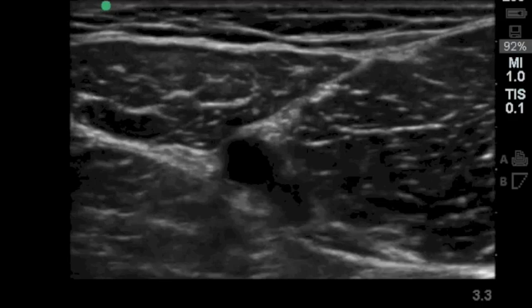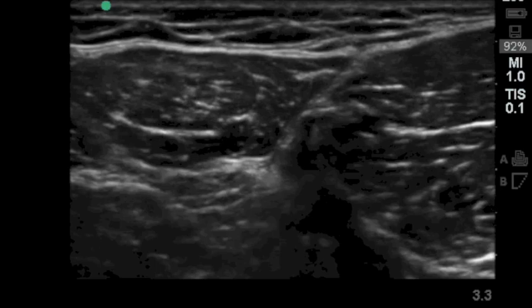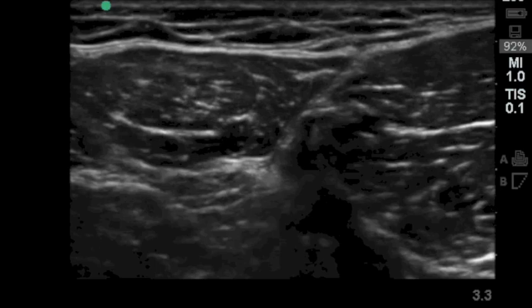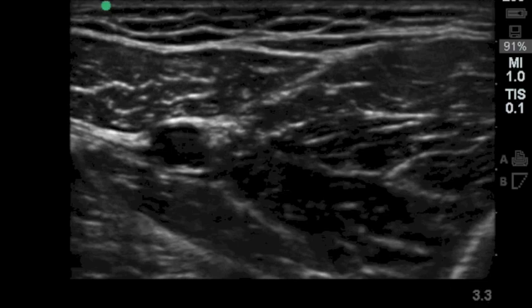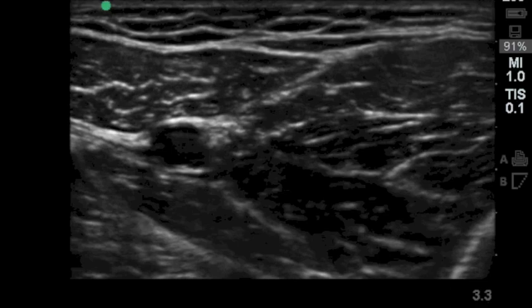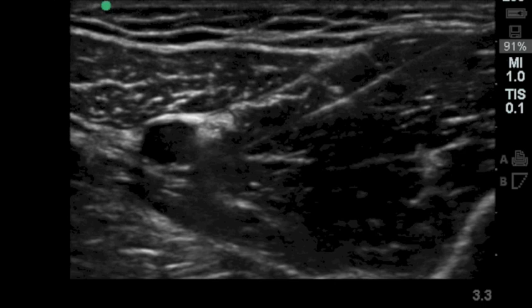This is a live example of a saphenous nerve block. Clearly you can see the femoral artery. We're adjusting the probe to get the best view. We'll also demonstrate how the artery dives as you move in a caudad fashion, which you can see happening right here. Once that's happened, we're going to pull back cephalad until we get a good clean view of the artery. We'll move that off to the lateral aspect of the screen to the left. You're going to see the needle come lateral to medial, from right to left across your screen — in this instance, blocking a left leg. The target, as we talked about, is underneath the fascial plane, which sits just below sartorius muscle, which you can visualize there.